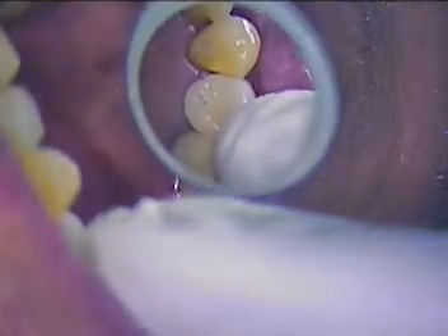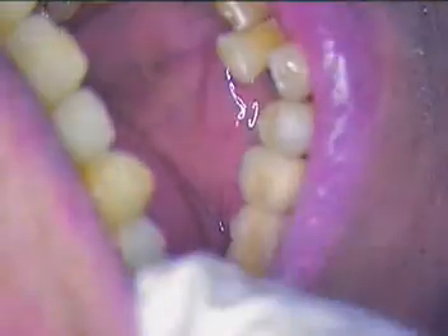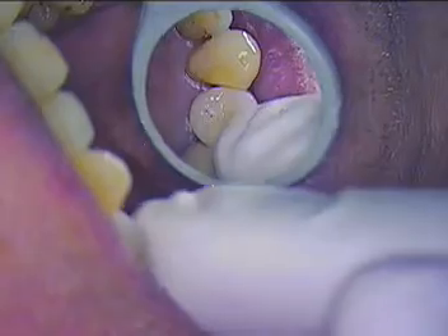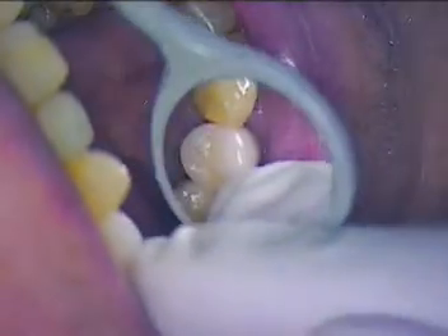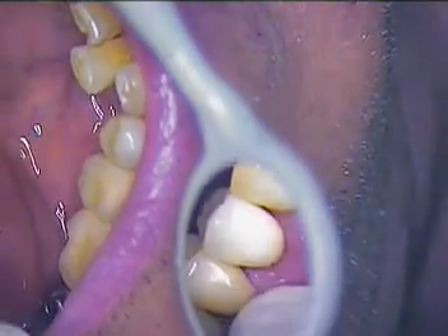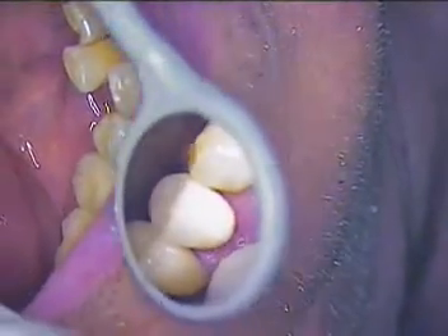We went with a lighter color because Luigi wants to bleach his front teeth. It does feel tight, so I'm going to spend the next few minutes adjusting the contacts — I'll use a pencil mark on one tooth and adjust until it seats all the way down. So far I like what I see; it has nice contours especially around the gingival area.